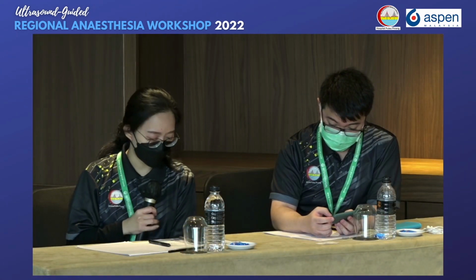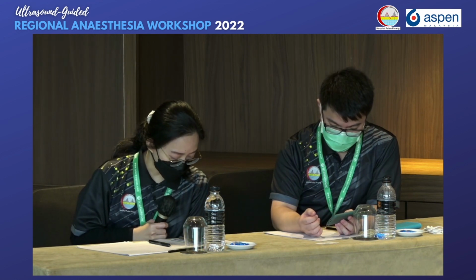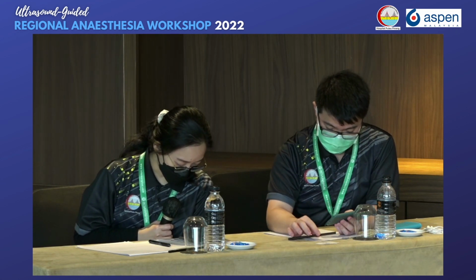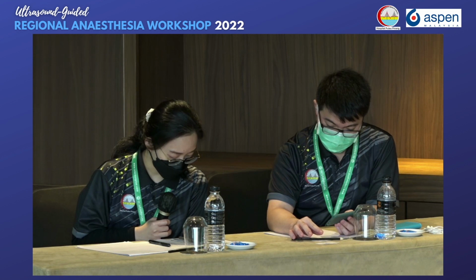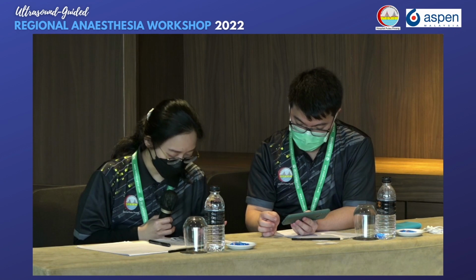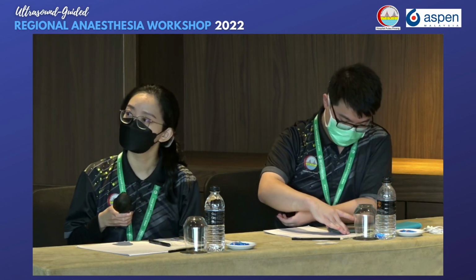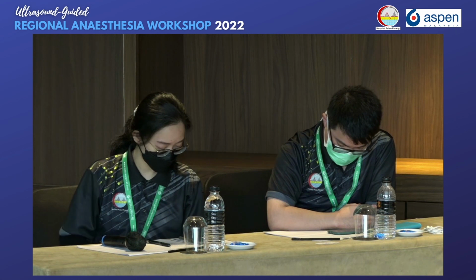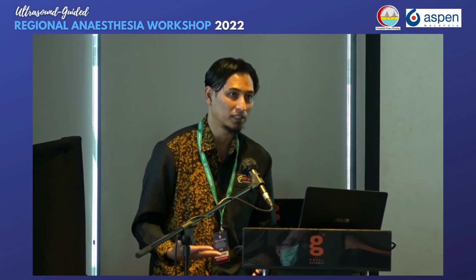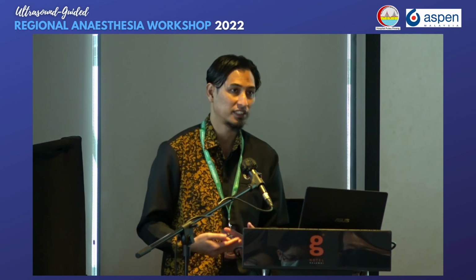There are a lot of questions regarding ESP, so I'll combine these questions. If we insert a catheter for ESP, what is the length of the catheter to be left inside? And also, do you insert a catheter for ESP for mastectomy? Depends. To insert a catheter for mastectomy ESP depends on the patient's factors. If you assess the patient and a catheter would be beneficial for that patient, yes, you might. But most of the time, if it's a straightforward case, we just give a single shot.